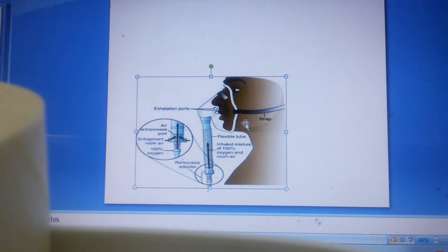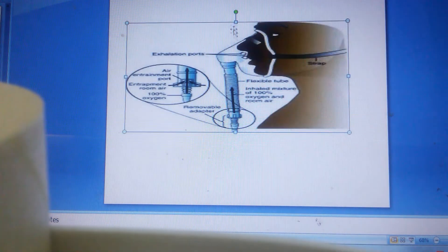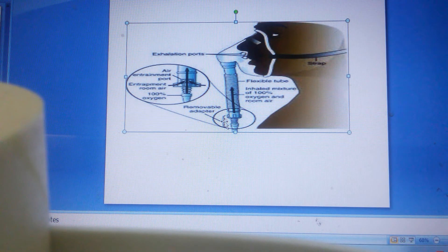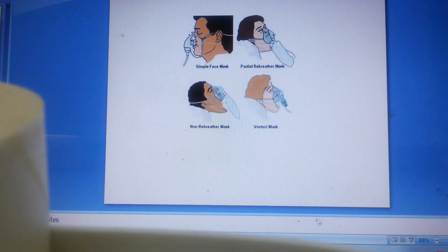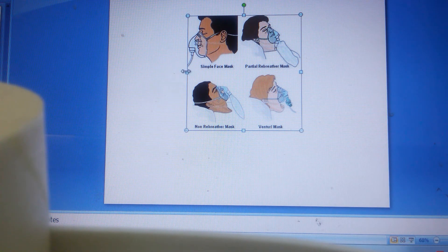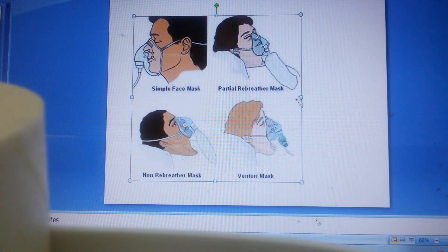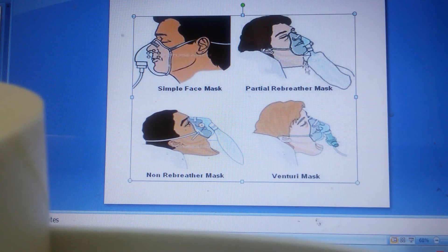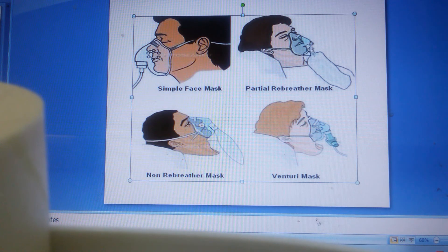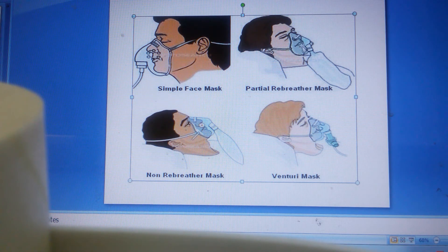This is a picture of the Venturi mask — the valve is placed here and according to the color code it provides the corresponding FiO2. Next is the simple face mask. This is the partial rebreather mask. The vents of this mask are opened, and there is no valve between the reservoir bag and the oxygen mask — that is why the client will re-breathe one-third of exhaled air.